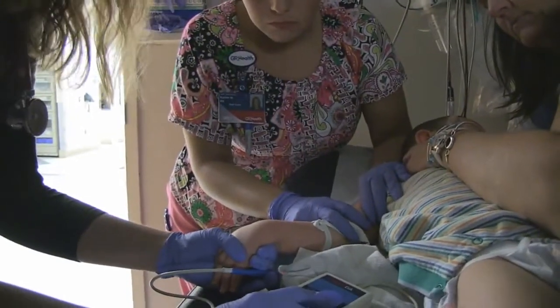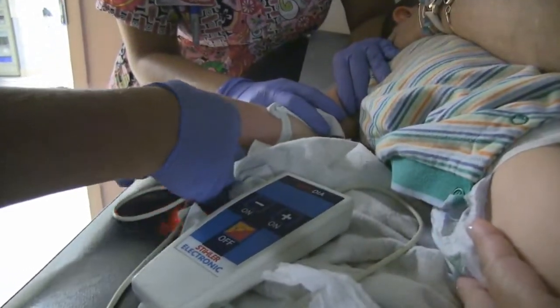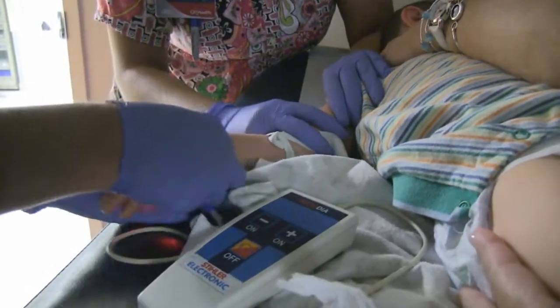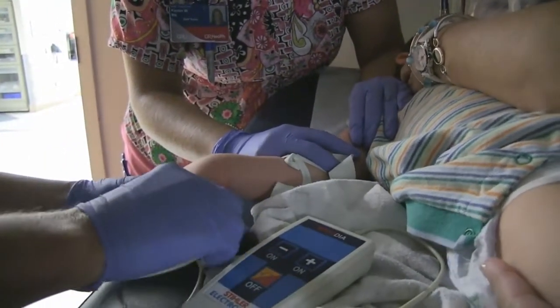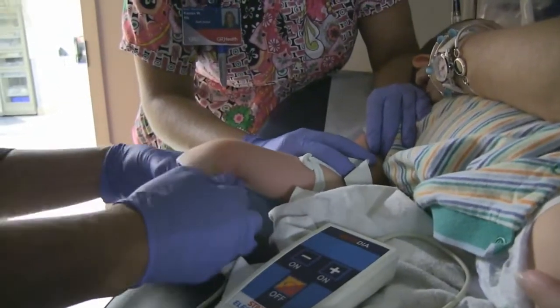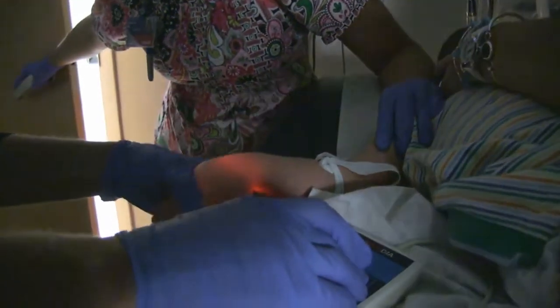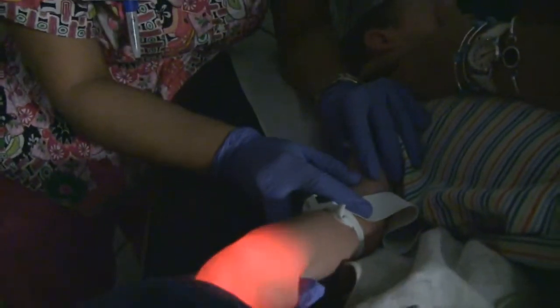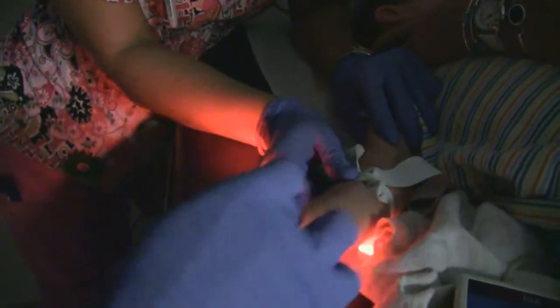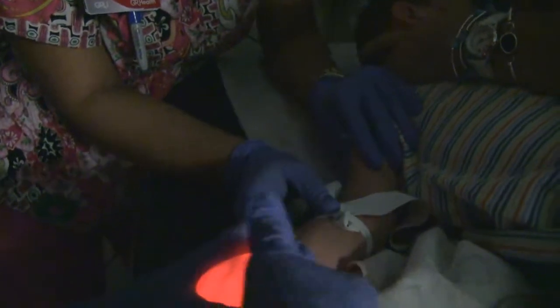It's going to be dark in here a little bit. This is a trans-illuminator light. For light-skinned people we usually use the red side — it has two sides, a red and a yellow. As you can see, that looks like a vein right there. There's a vein here, a vein here — that's a big one. That light just trans-illuminates through.